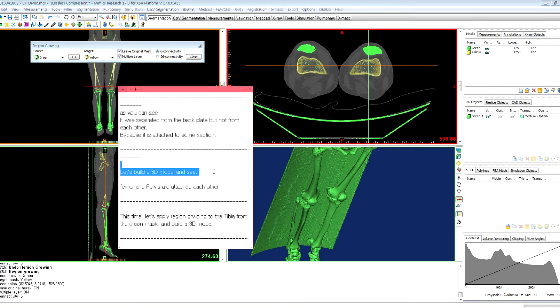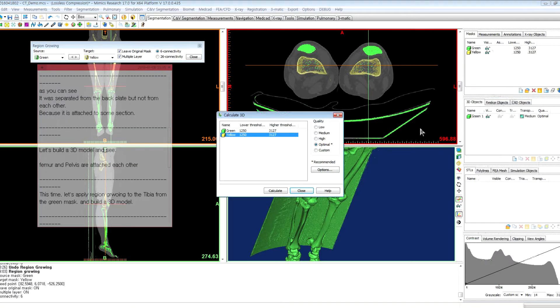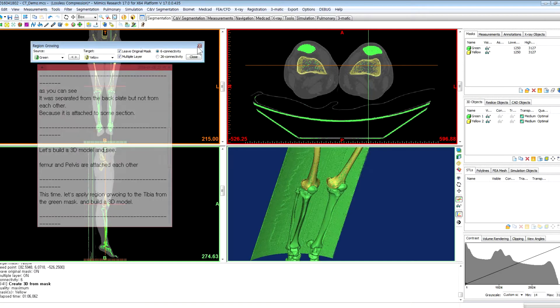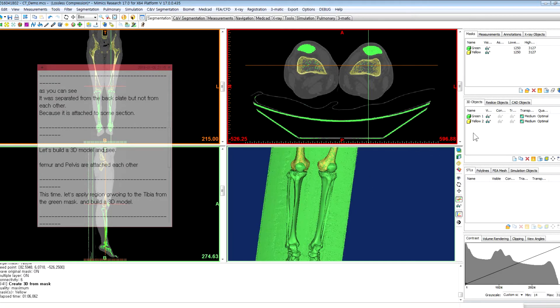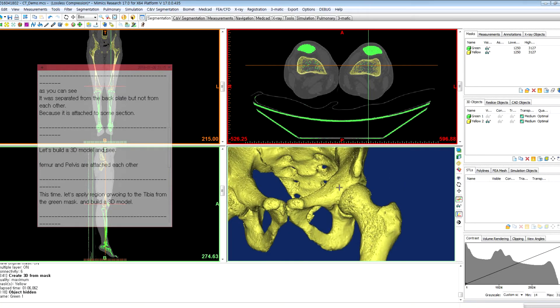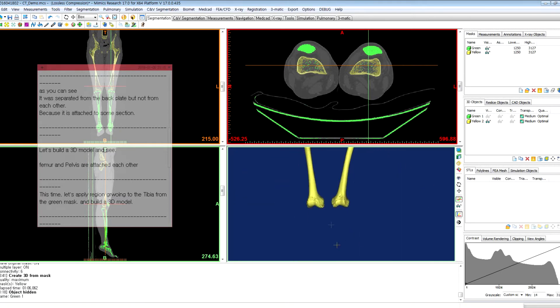Let's build a 3D model and see. Click the right button, calculate 3D, check optional, and click calculate. Then close the region growing window and hide the green mask. As you can see, the femur and pelvis are attached to each other, and there is no tibia.